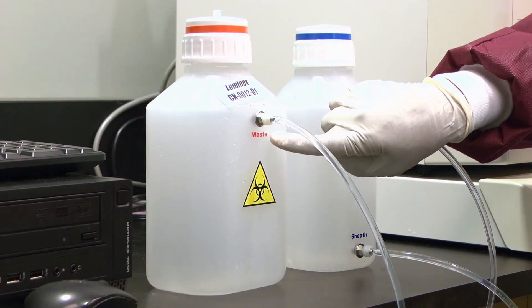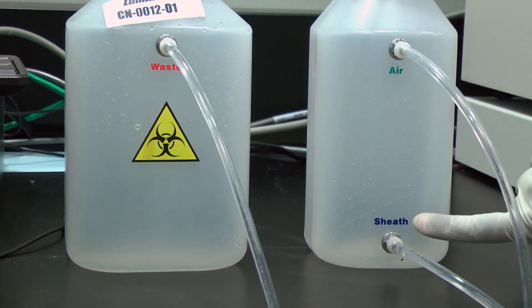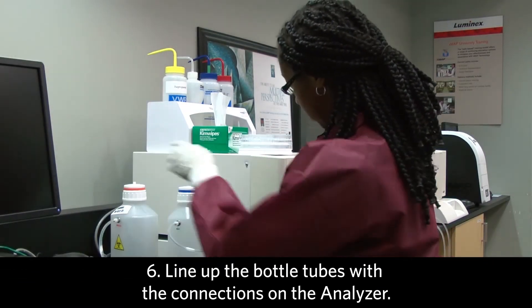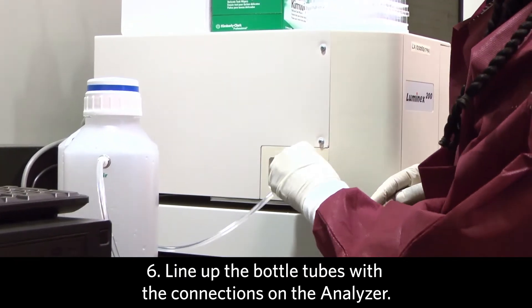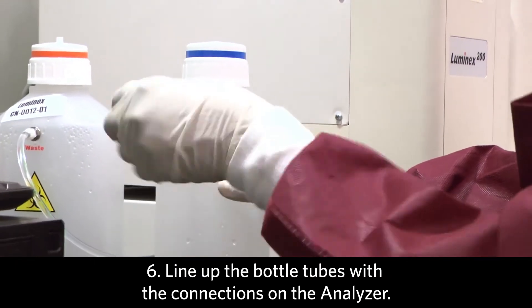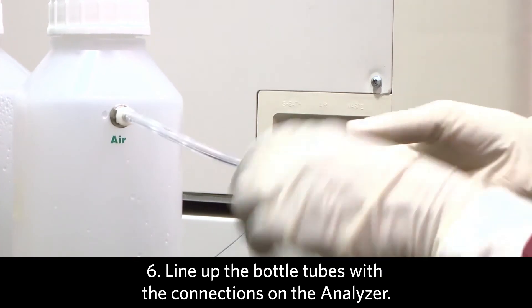There's a sheath waste bottle and a sheath bottle with the air connector and the sheath connector. Make sure to line up the tubings from the bottles to the wording and the connections on the analyzer: waste, air, and sheath.